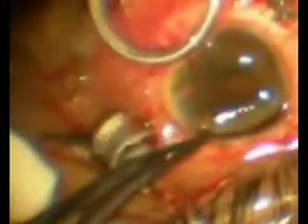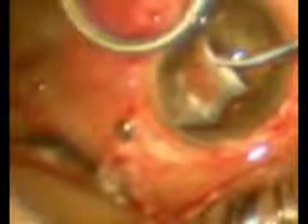Lens forceps was used to lift the corneal flap and the foreign body was now delivered out from the eye. The cornea was put back into its place, and you see this large foreign body which was taken out from this eye. The limbal section was then sutured using 10-0 monofilament nylon suture.